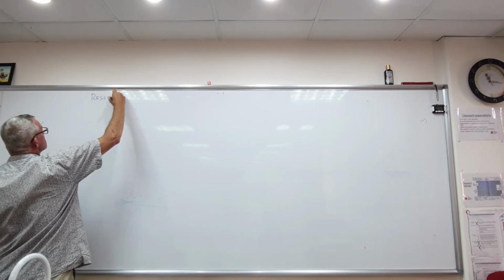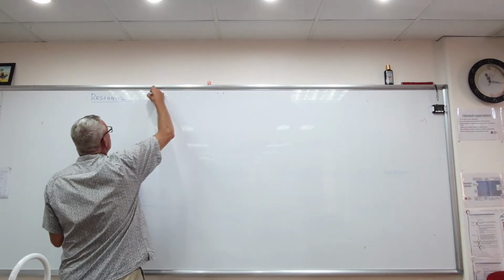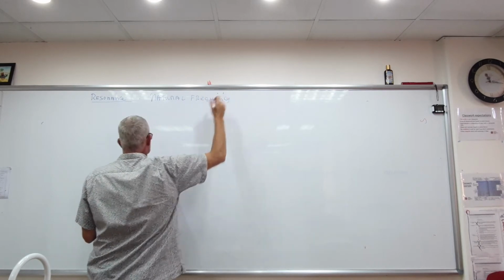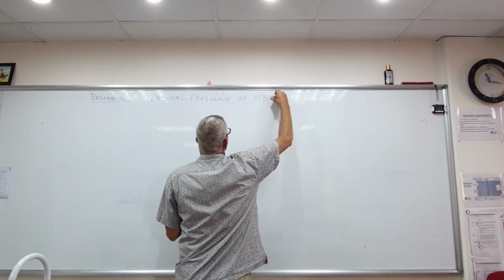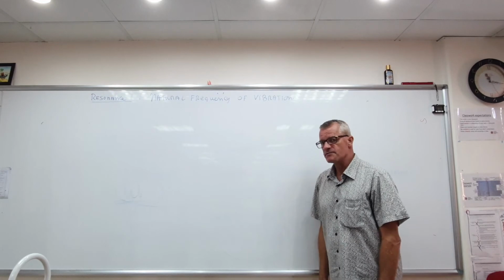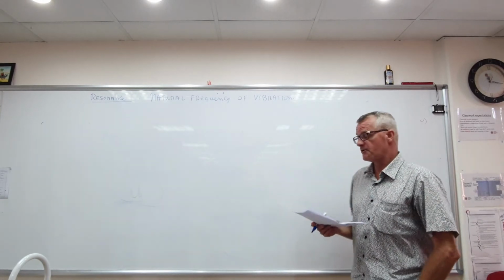Resonance. Okay. What about the resonance? Remember, that was the natural frequency of vibration. Now remember, when we put a magnetic field of 1.5 Tesla over the protons, it will spin around with a frequency of exactly 64 megahertz.